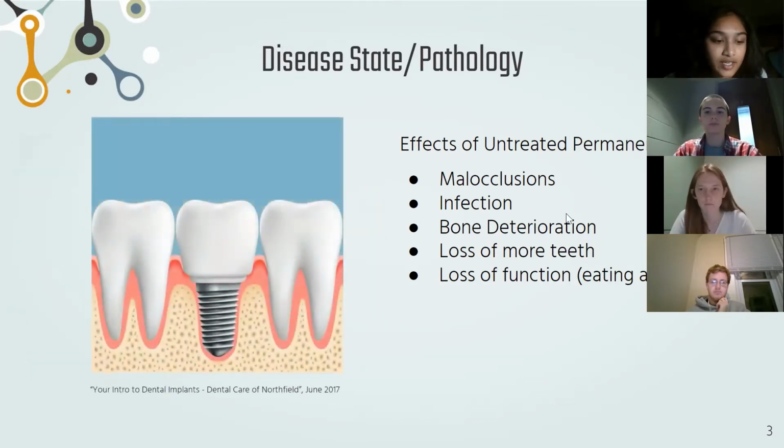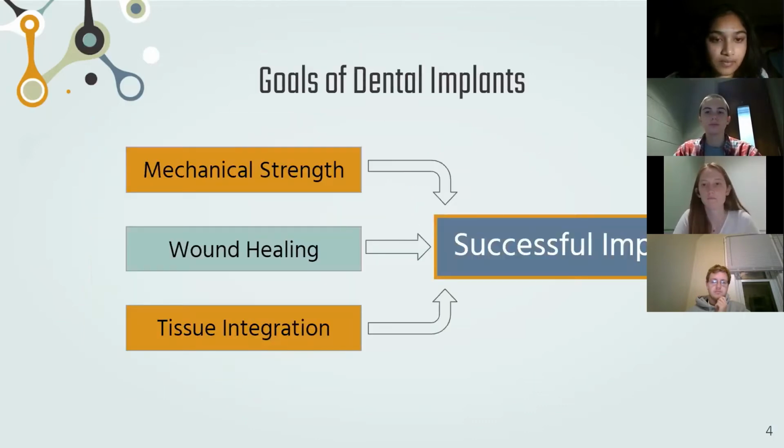Dental implants are a good replacement option for this because they interface with the bone as well and restore root function, and not just the crown. So in restoring the functions of the root and the crown, current dental implants aim to, one, accomplish this by using a material that can withstand the forces exerted on the teeth and jaw during daily life.